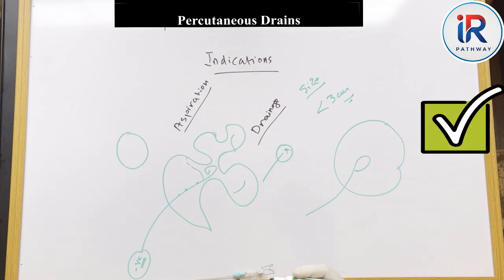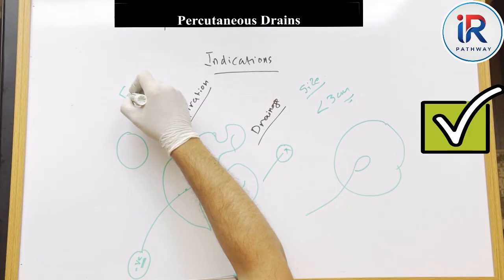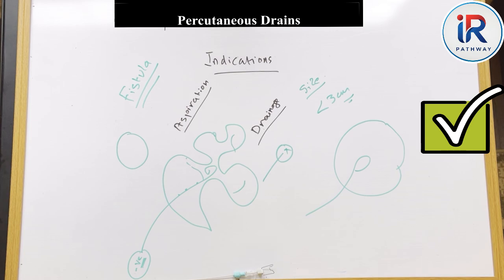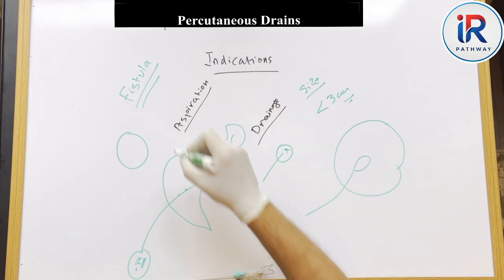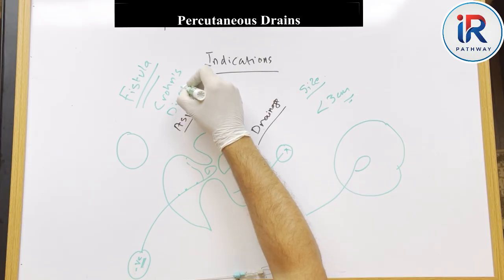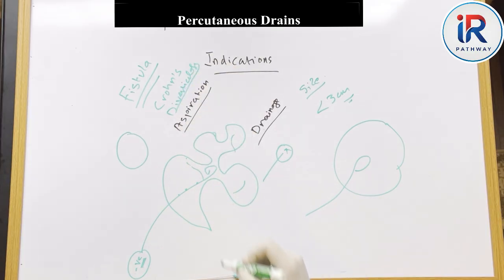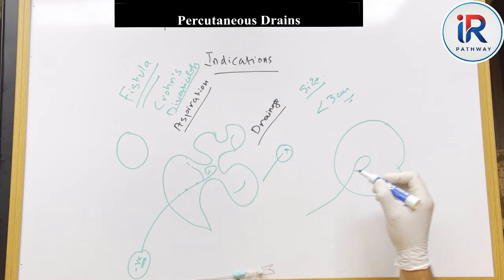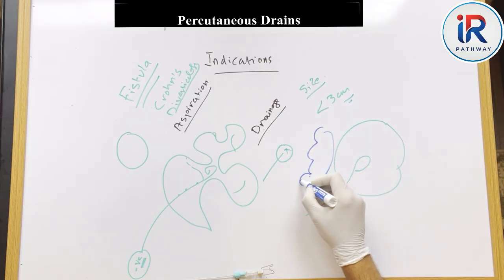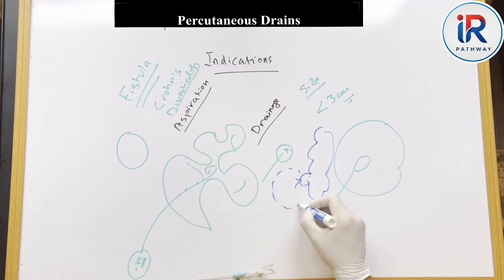One important point surgeons always emphasize is the presence of fistula. If a fistula communicates with the collection, drainage is preferred over aspiration. This is commonly seen in Crohn's disease patients, and in diverticulosis complicated by diverticulitis, where a contained perforation and abscess are formed. So the idea here is, let's say that this is the colon. The idea is that this colon may develop a perforated diverticulum that communicates directly with the fluid collection.